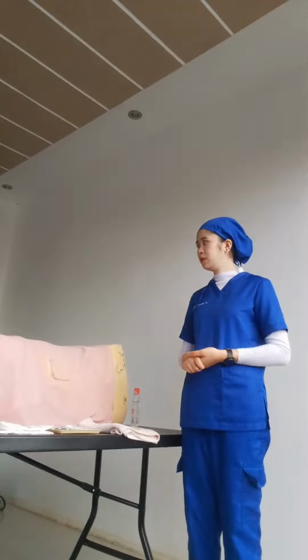Then a specimen of CSF is removed and usually collected in 3 test tubes labeled in order of collection. A pressure reading may be obtained, and the needle is withdrawn. The physician applies a small dressing to the puncture site.